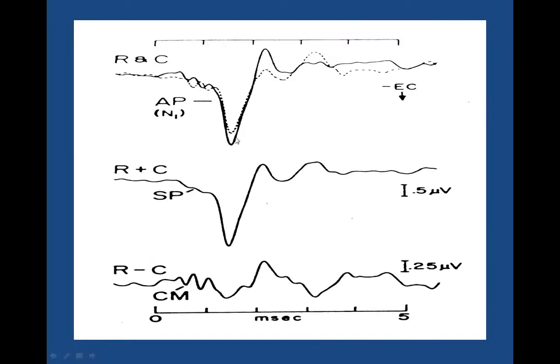I will tell you how to alter the polarity of the response depending on which way you like to see the peaks. Some people like to see them going up, some people like to see them going down. Personally, I like to see ABR peaks displayed as upward deflections and electrocochleogram displayed as downward, but that's just a simple matter of reversing the inputs to the preamplifiers, as long as you know you've done that and in which directions the peaks should be going.